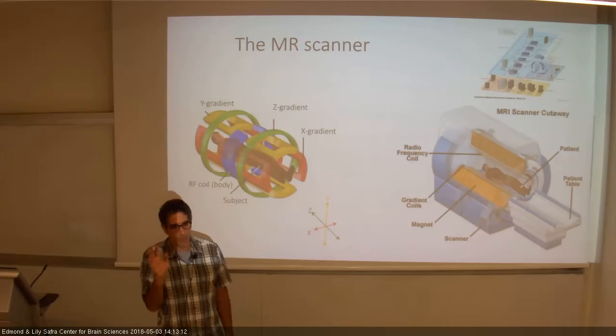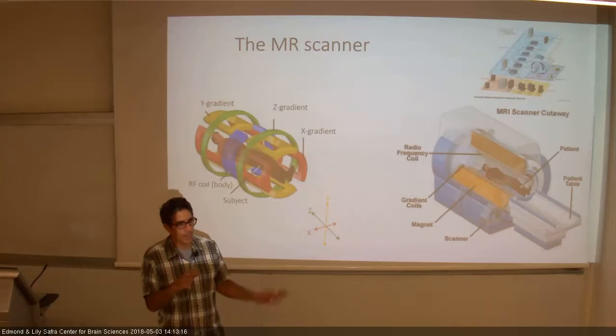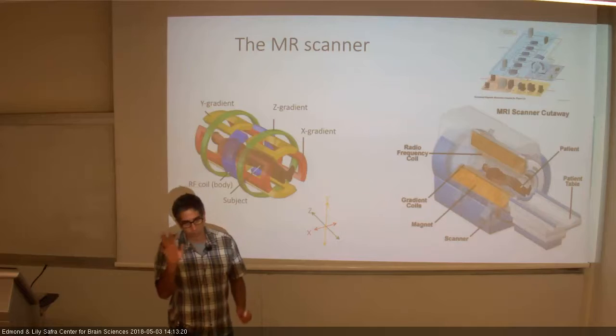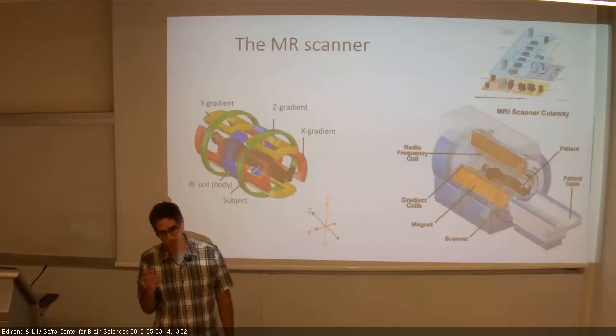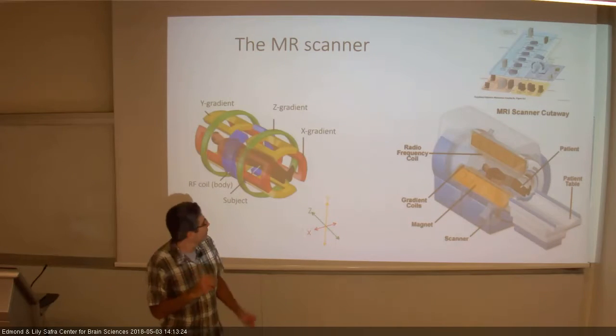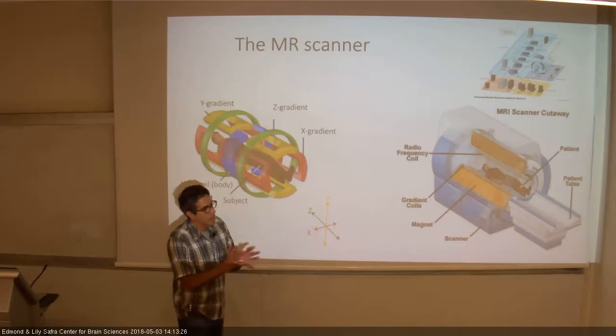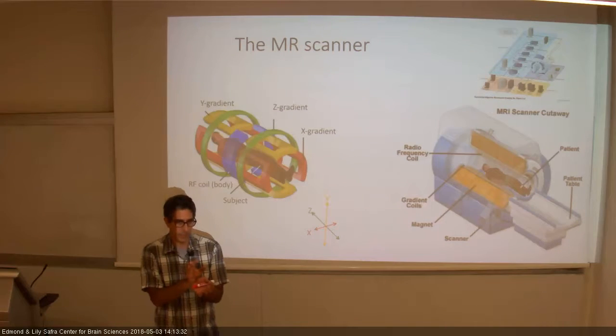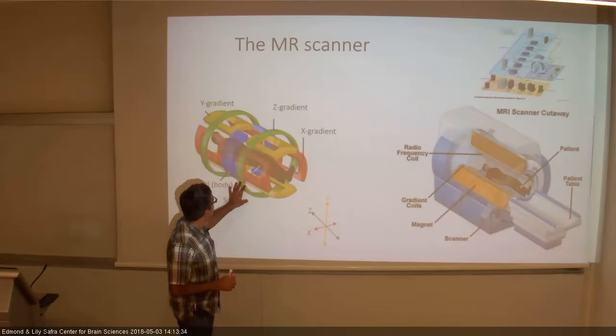Some of you maybe learned in chemistry or physics, there is a machine, NMR, very useful. Here we're doing NMR, but as an image, and only for protons, only for one type of atom. We're going to talk about it in a second. And this gradient is going to create some perturbation in the magnetic field that would allow us to make an image of a volume. So that's what it's used for.